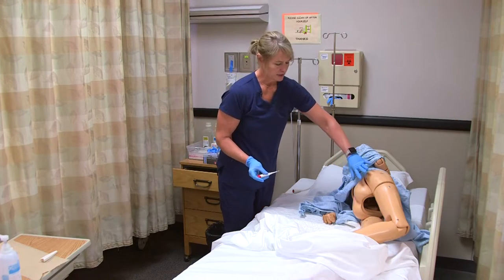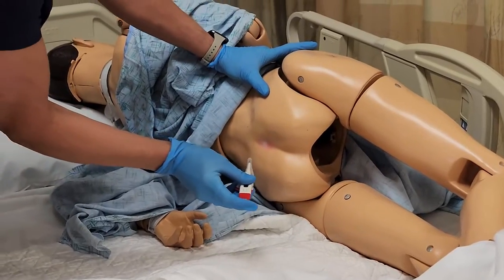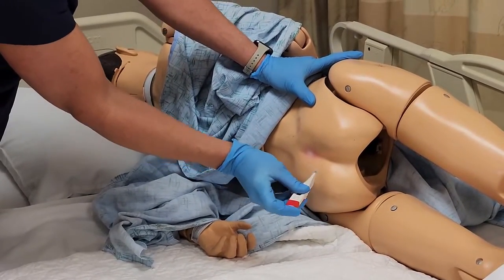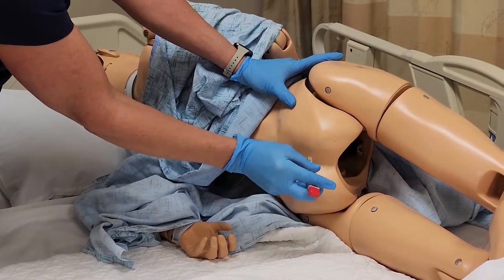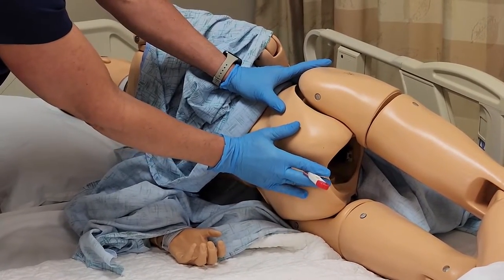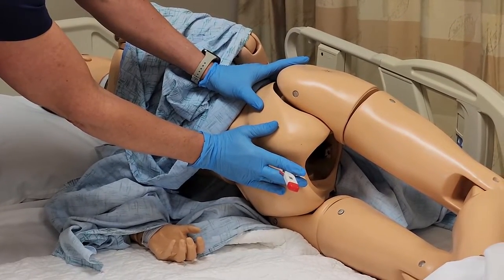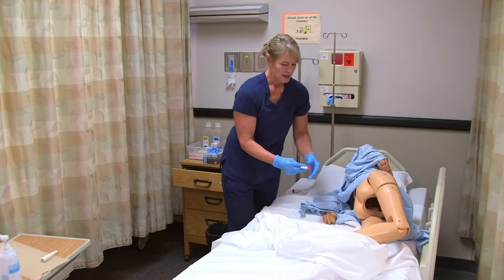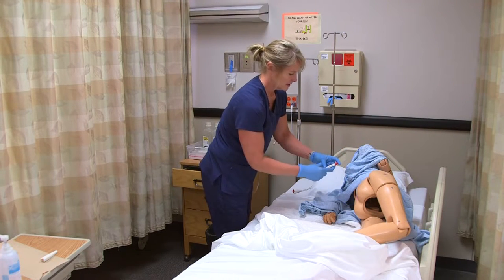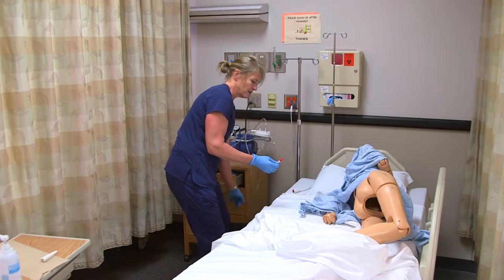This position puts the colon in an easier route to insert the rectal thermometer. I can insert that into the mannequin, but if I had that in an actual person, I would hold my hand there so the thermometer doesn't go in too far. When it beeps, I would take that out. I can use a wipe to get any of the lubrication off and get the reading, then throw that away.